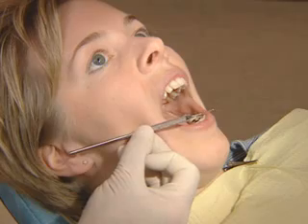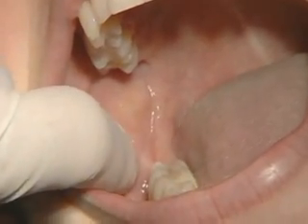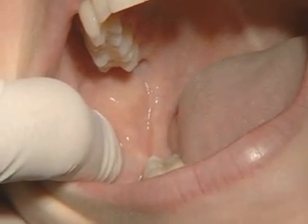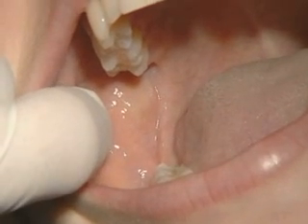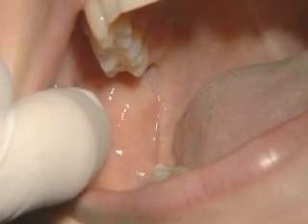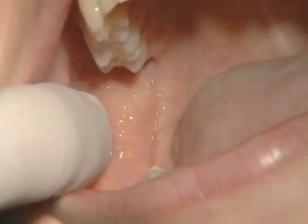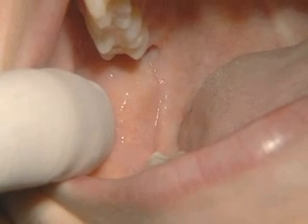Once the angle is determined, you are then able to begin the injection by palpating your intraoral landmarks. And as with all three techniques, you start off by feeling the anterior border of the ramus. My finger is now in the coronoid notch and the external oblique ridge, and I move it upwards superiorly until I feel the coronoid process. And at this point, I can feel the insertion of the temporalis muscle.